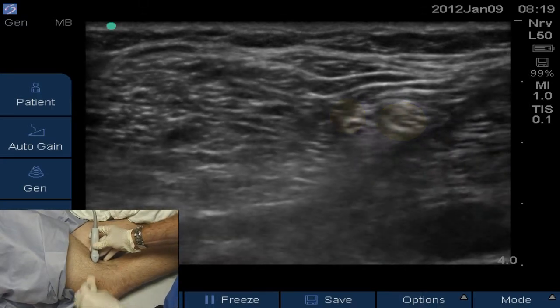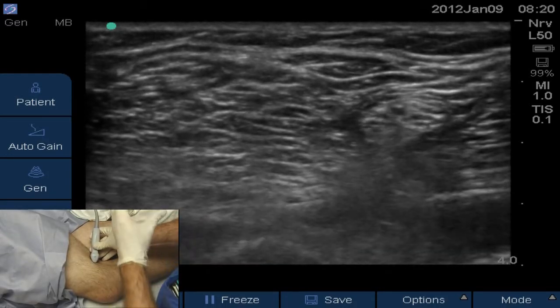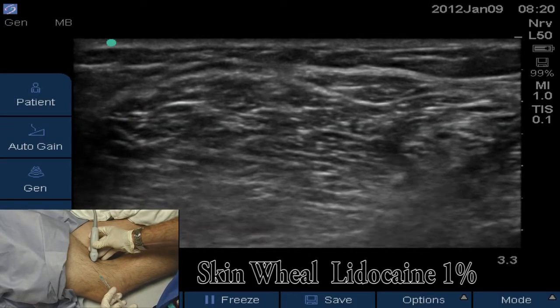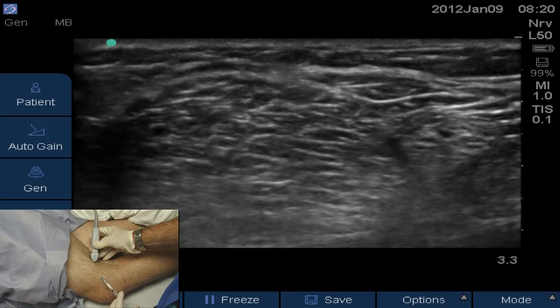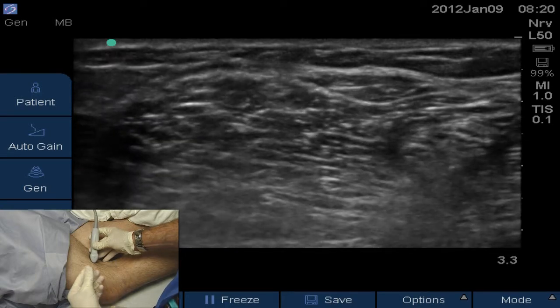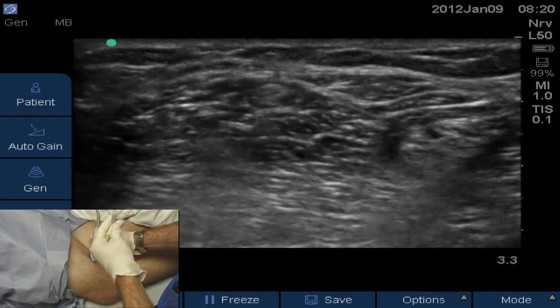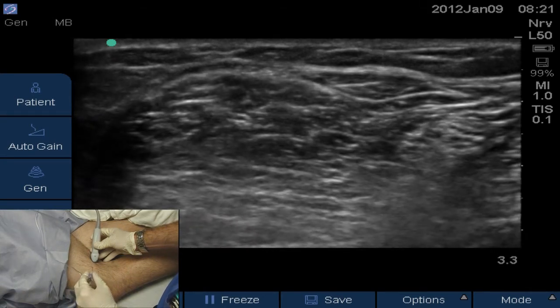Okay, I'm going to clean you off. Notice the target has moved to the right, medial side of the screen, and it's only about 2 centimeters deep — rotate the depth knob one to the left. Big bee sting, big pinch and a burn. This is that numbing shot — it's going to numb the skin up. Infiltrate several centimeters lateral to the probe, then follow with infiltration along the track the needle's going to take. You can almost reach the nerve with the 25-gauge finer needle. We'll be using a 22-gauge Tuohy needle connected to sterile tubing, non-stimulating approach.